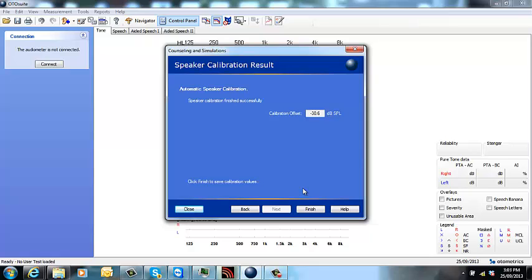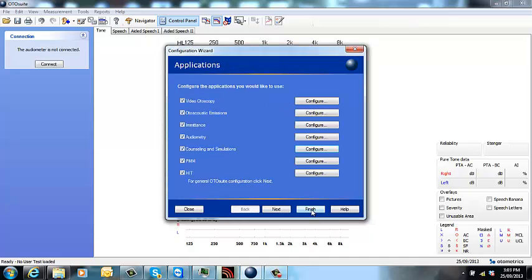You'll then be given a calibration offset. The offset is what the offset is. There's no alteration that you need to make to that. Once you're happy, click finish.